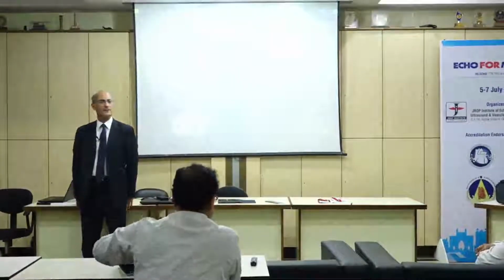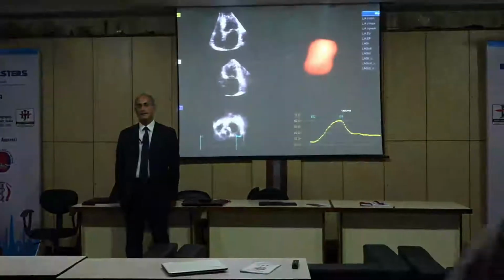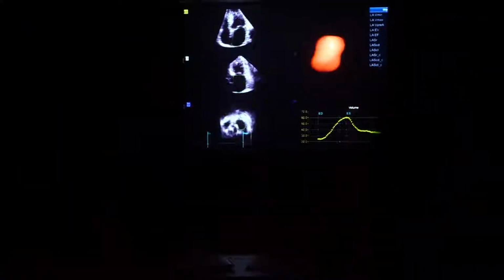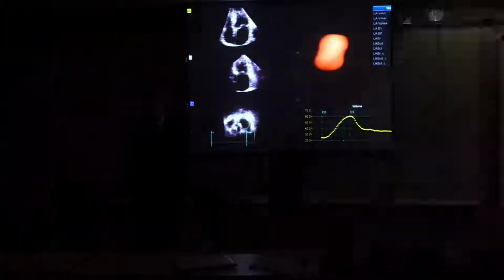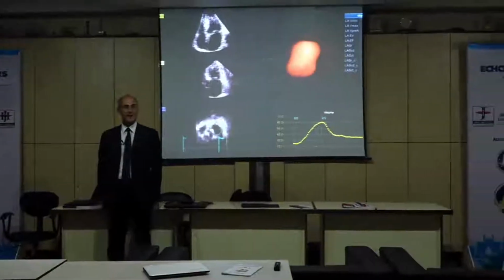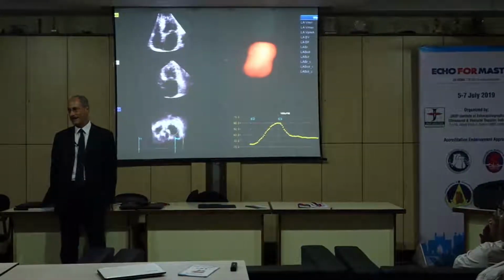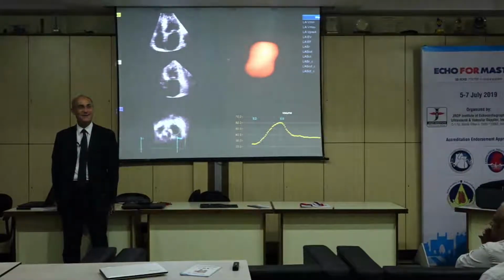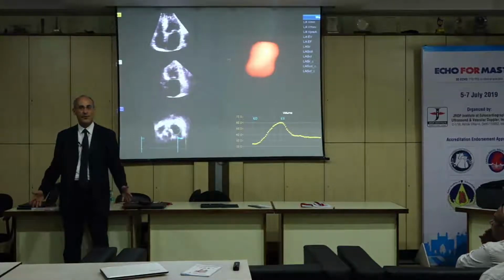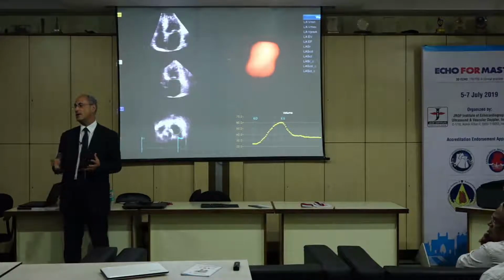Any difficulty on the left atrium? If it's the easiest, yes, it's very simple. Okay, so we have concentrated in one morning 10 years of work that we have done in our lab. I hope that it's been, of course, a quick overview.